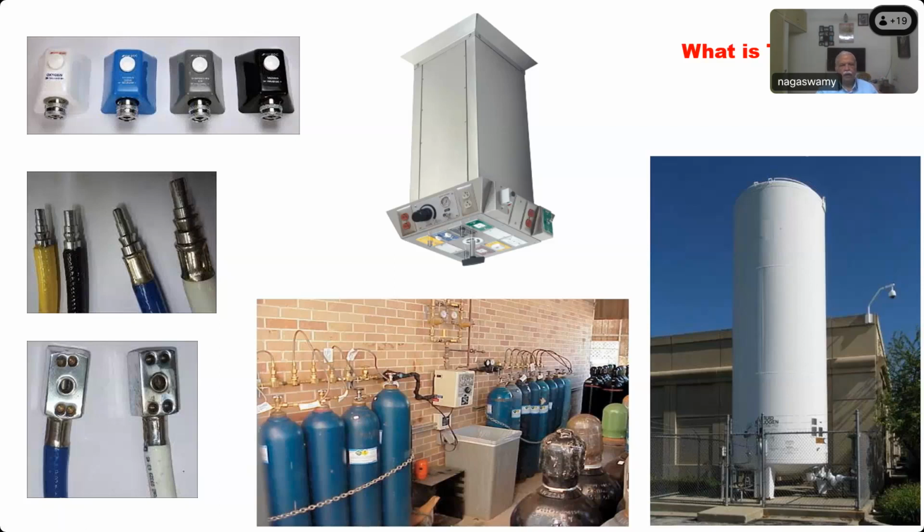Once you push it in and it is properly fixed, when you give a tug, that hose should not come out. That is a very important point that you have to remember.